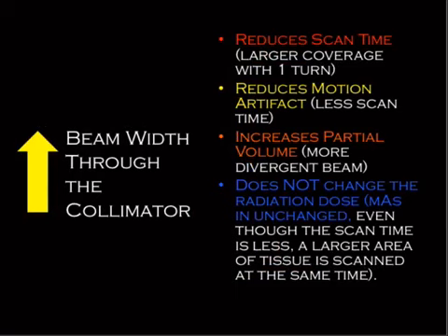Well, if you've got a bigger, fatter beam, it's going to reduce the scan time because you're scanning more per turn. It's more resistant to motion artifact because there's less scan time, less time to move. With those super fast modern scanners, they often don't even give the patient breathing instructions because there isn't even time. You're talking about half a second or a quarter of a second, you don't have time to fire your diaphragm.